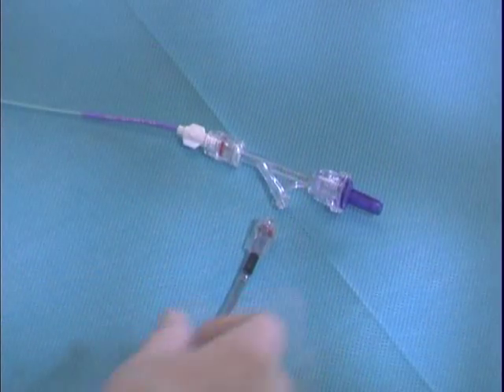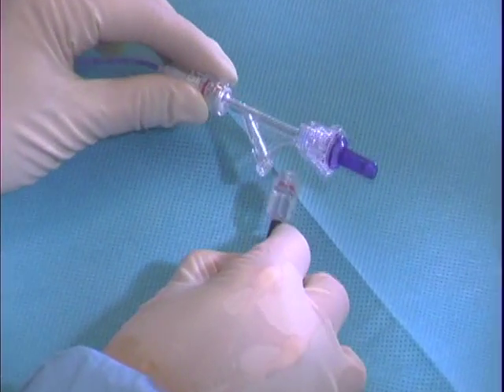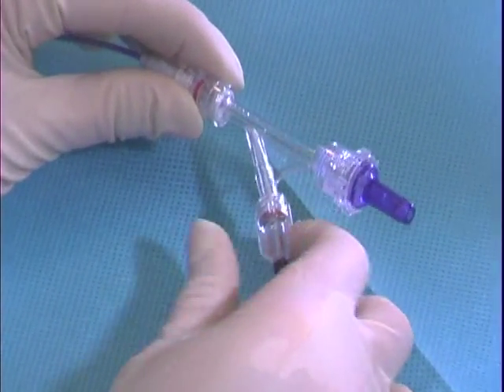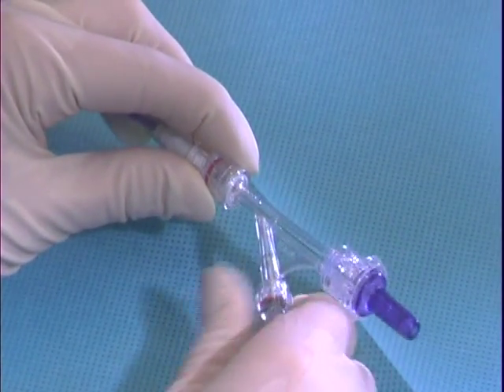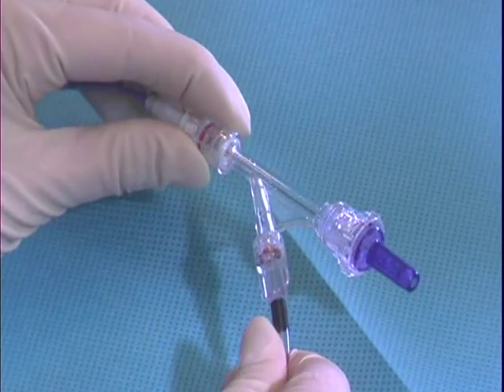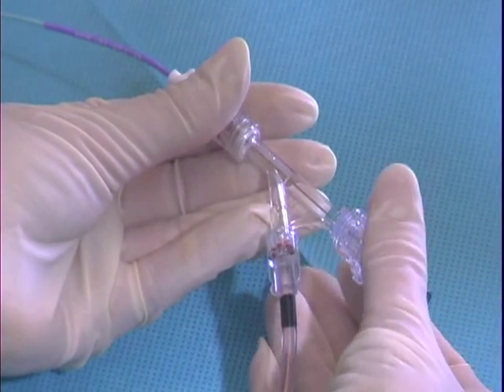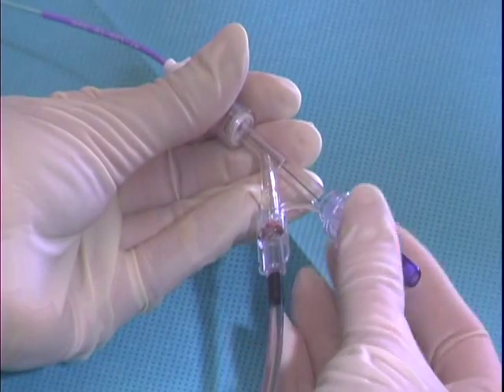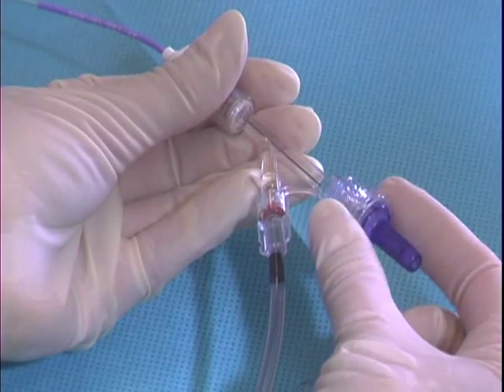To connect the Fountain to an infusion pump, simply connect the male lure at the end of the infusion pump tubing to the connector on the hemostasis valve as shown. To avoid the introduction of air, loosen the hemostasis valve cap and allow a small amount of solution to flow back out of the hemostasis valve. Once fluid has gone through the valve, tighten it back down.